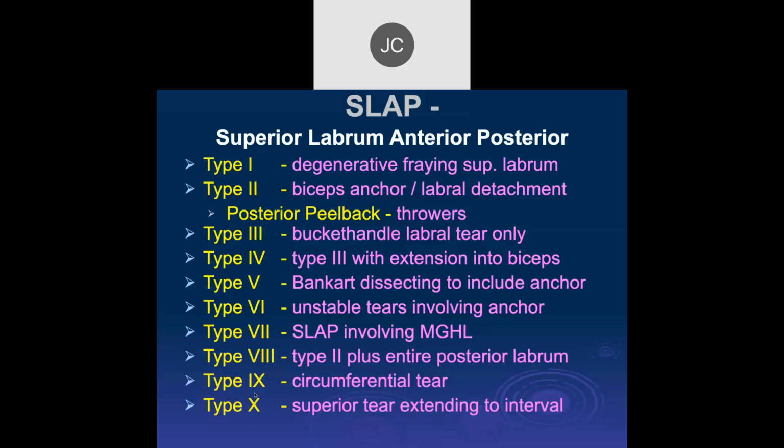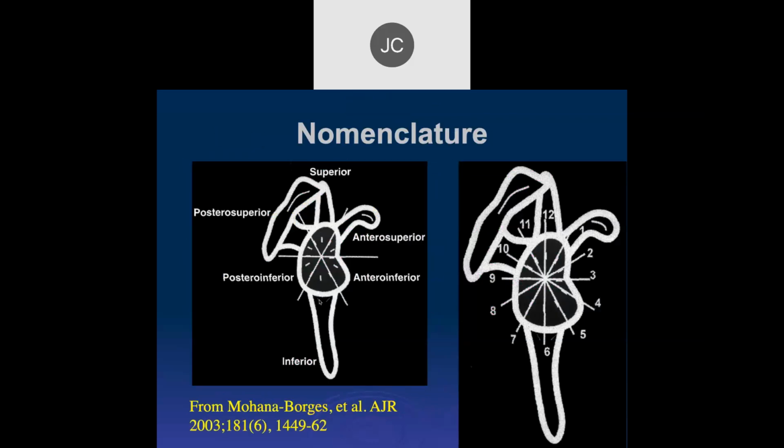These higher levels are mostly in the radiology literature. However, they're also in the orthopedic literature, where they actually refer to slightly different injuries than in the radiology literature. And the type 10 here at the bottom was actually described by an orthopedic surgeon in Santa Barbara. And we'll talk about that when we get to it.